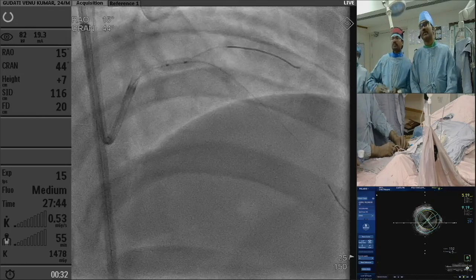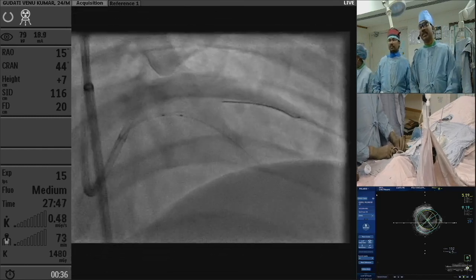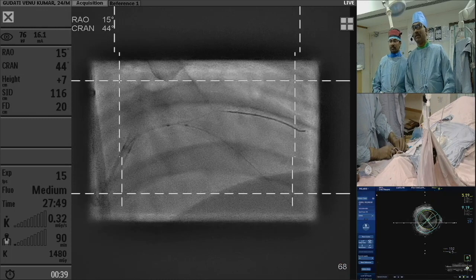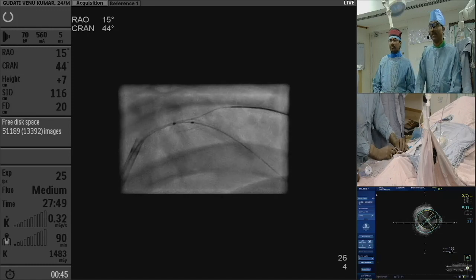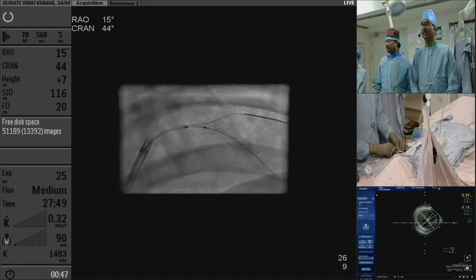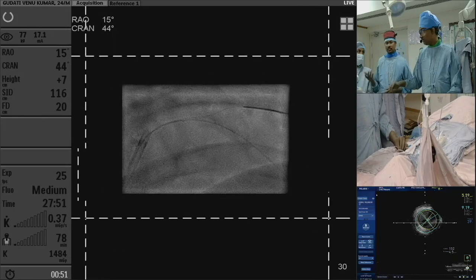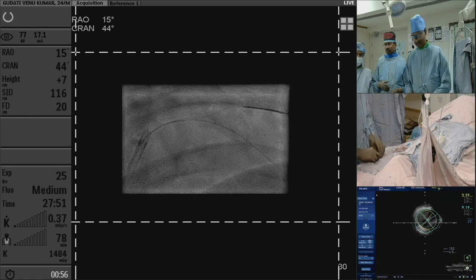Negative. Just give me sunburst. Just make me understand what I covered. 3 balloon, please. I think we covered everything. 3 NC, please. 8 or 12, no problem.